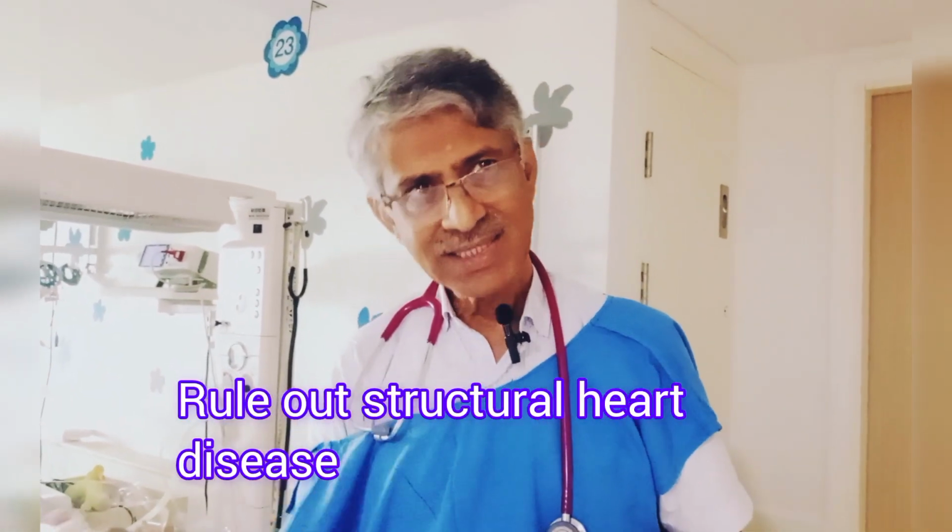Always remember that structural heart disease should be ruled out by a cardiologist. And if you see any variations in your segmental approach, please call a cardiologist.